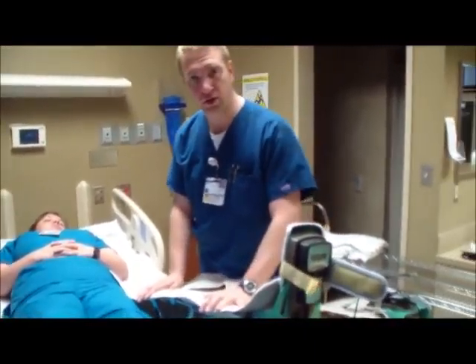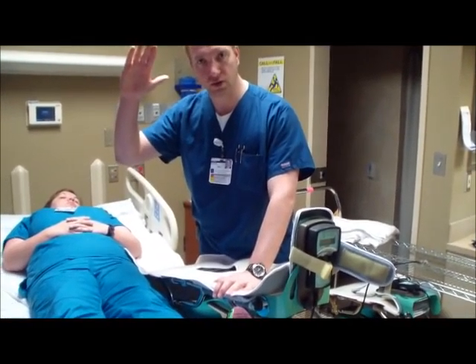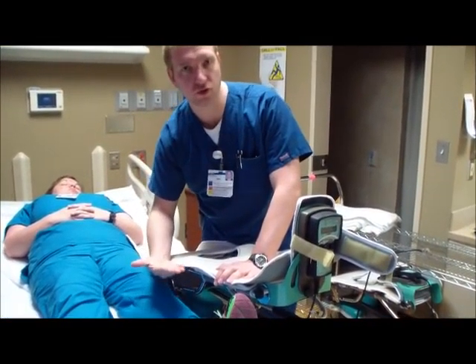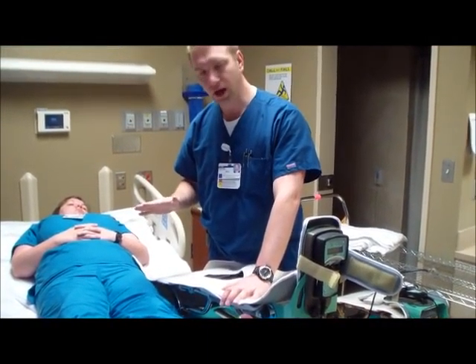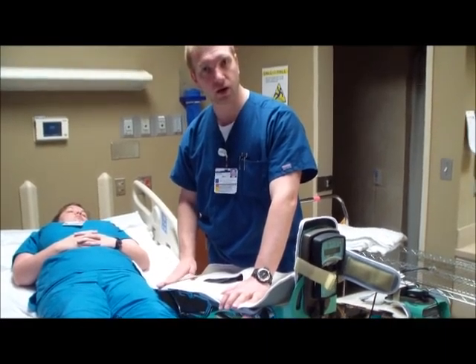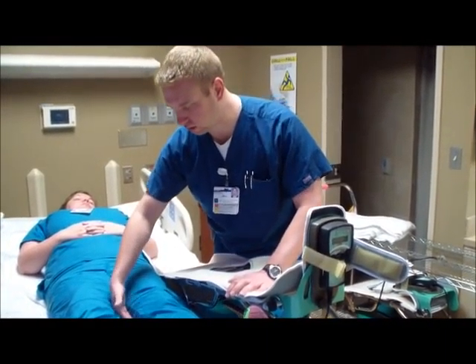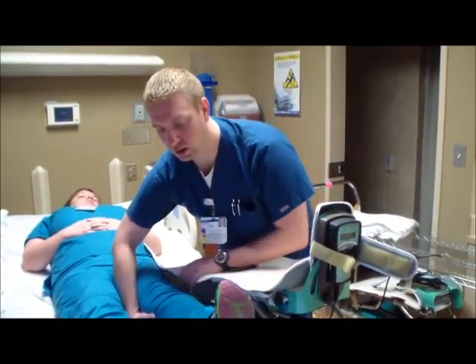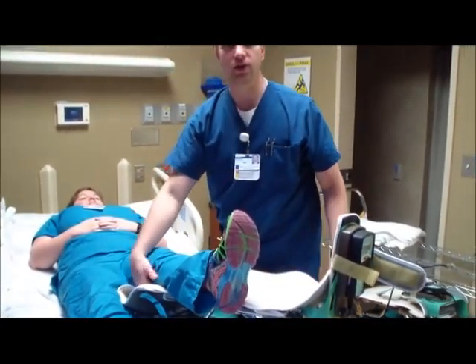So one of the things that you can do if you're on your own and you don't have any help from anybody is use your hand and scoop on the inside part of their leg to help lift them up. What really helps is making sure you get the top part underneath their leg first, because then from there it makes it a lot easier. So I'm just going to scoop underneath and lift up. You're helping. And I'm just going to place it just like that.